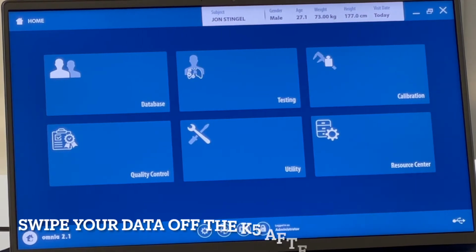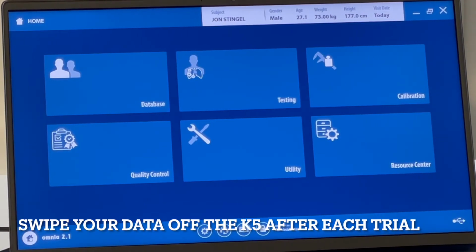I'm glad you brought that up because it's a good time to cover that. It stores 16,000 breaths. So really, what that looks like is, I believe their spec on it was like 24 hours of continuous resting data, or I want to say about 5 or 6 hours of continuous VO2 max data.